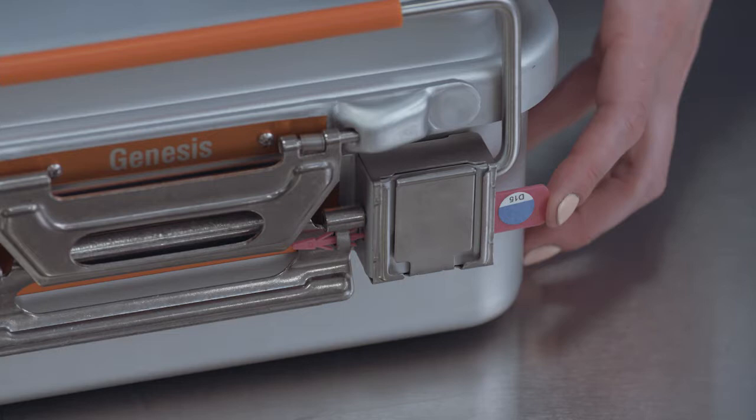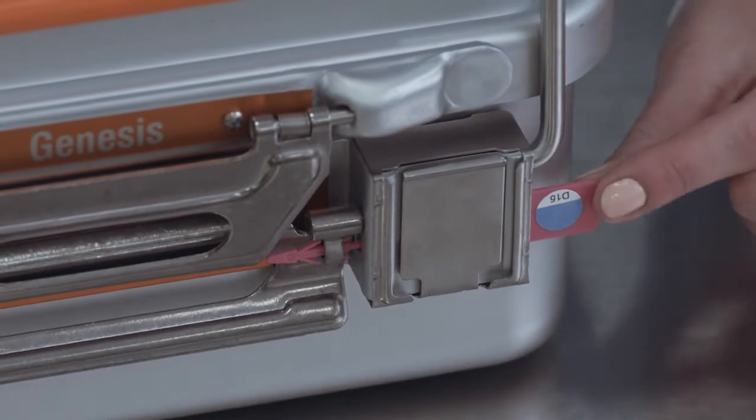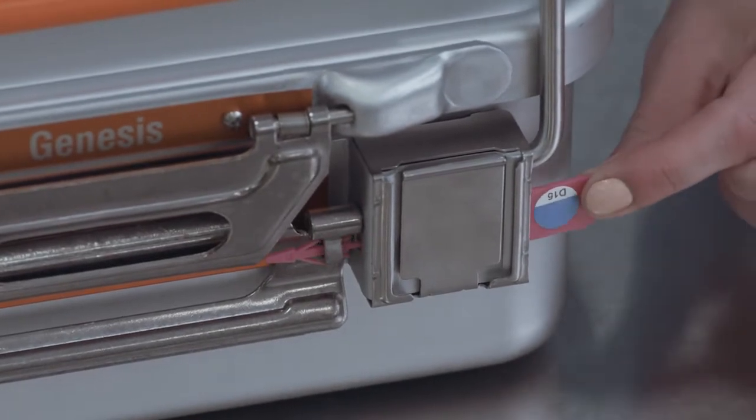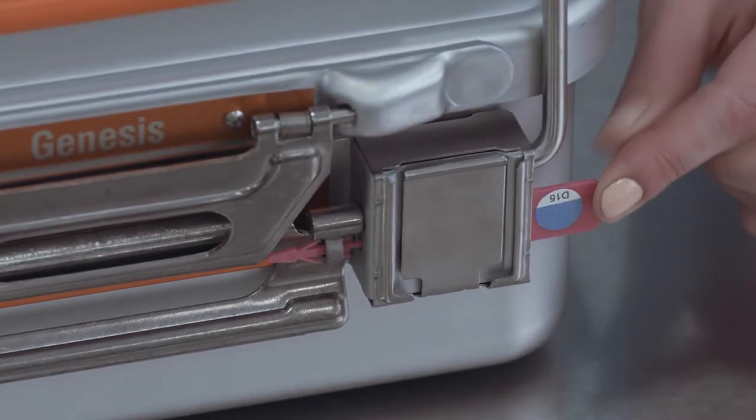Check for the physical integrity of both tamper-evident arrows. Grasp the arrow on the chemical indicator dot end and gently pull. If the arrow slips out of the channel, consider the contents of the container not sterile.